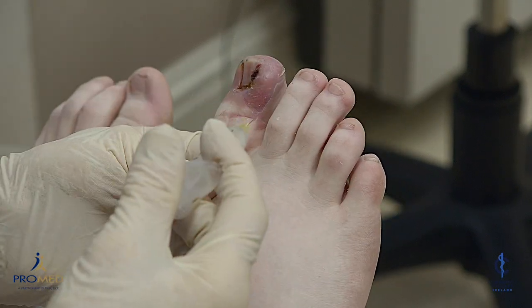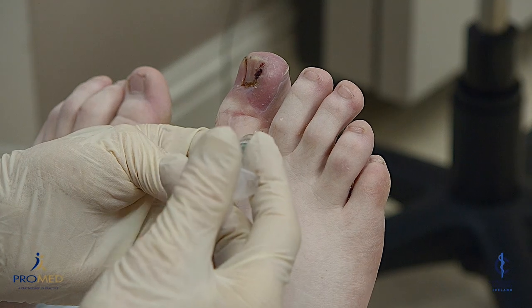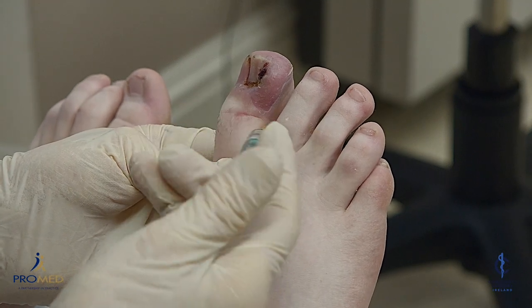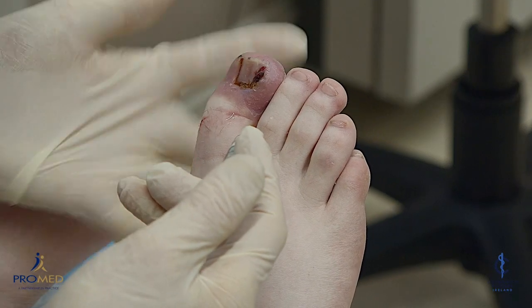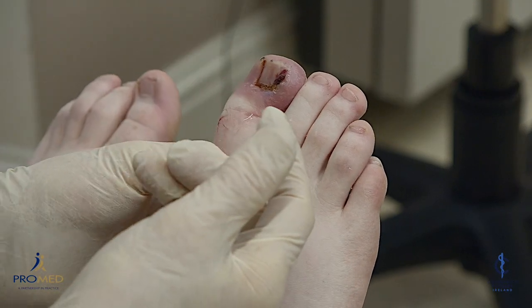And a small bit down at the back on this side as well. I'm making sure my finger is not anywhere near where the needle might come out.